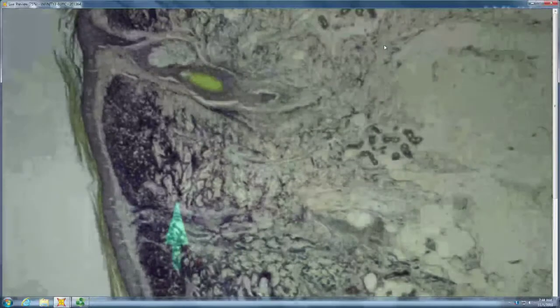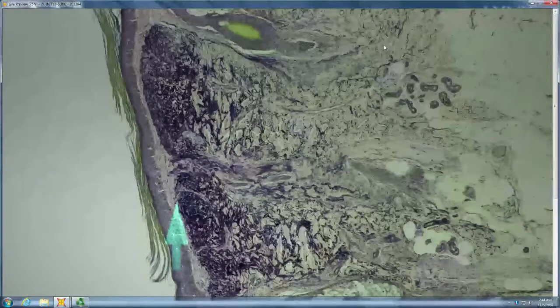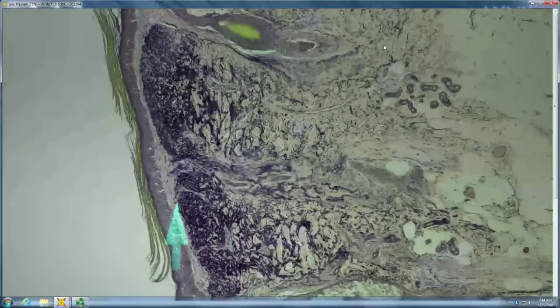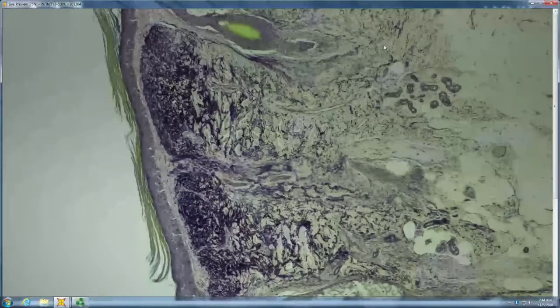So here's a pattern of abnormal. So what's wrong here? Too little or too much elastic? Too much elastic. Looks like solar elastosis, right? Which means, why is so much sun getting to that scalp? It's bald. Because you're bald, right? Because you're a bald golfer who doesn't wear a hat when you go out, right?